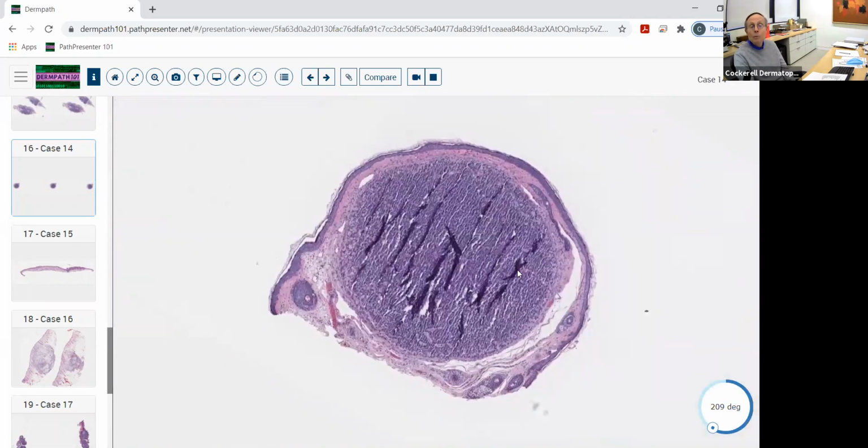Now, one thing about the painful tumors, they don't all have to be painful, interestingly enough. We see lots of lesions submitted to us under the microscope that are just sent in as regular garden variety lipomas. So obviously that means they're probably not too painful, or the clinician would have put that down. Yet they show histologic features of an angiolipoma.